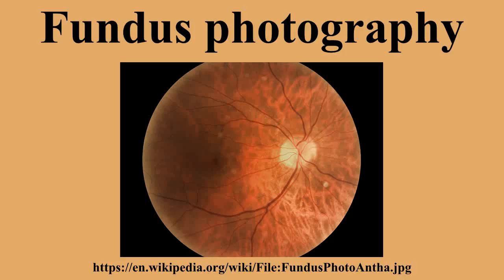The models and technology of fundus photography have advanced and evolved rapidly over the last century. Since the equipment is sophisticated and challenging to manufacture to clinical standards, only a few manufacturers' brands are available in the market. Optos, Zeiss, Canon, Nidek, Kowa, CSO and Centervue are some examples of fundus camera manufacturers.